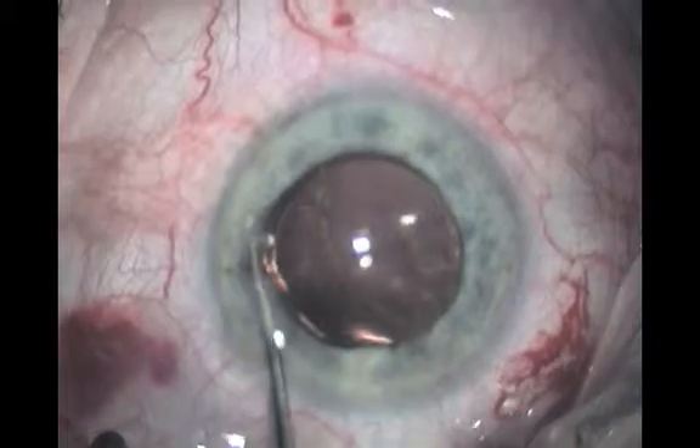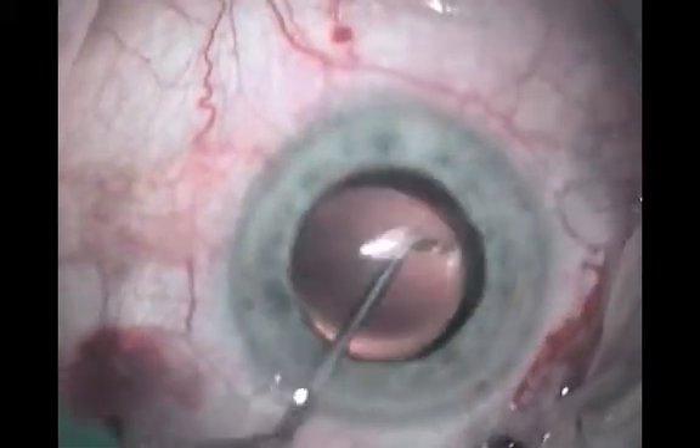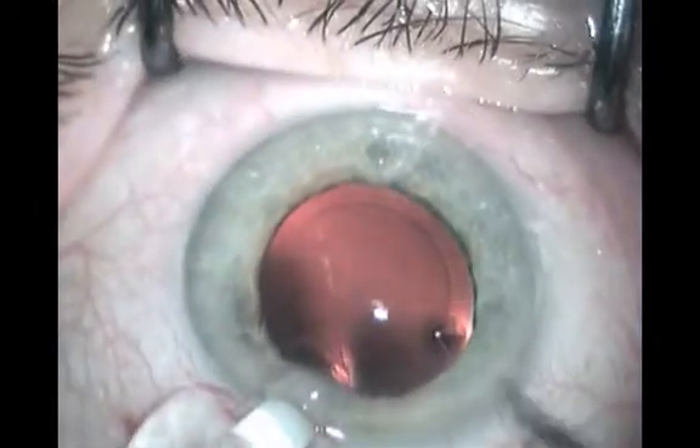At times, however, particularly where there are major capsular bag or zonular problems, gentle safe insertion of an IOL is of paramount importance.